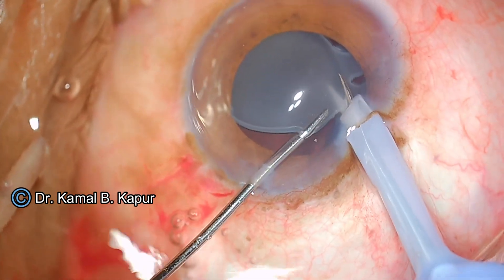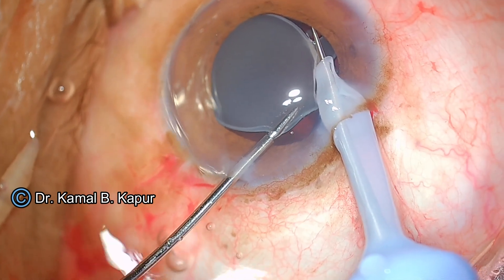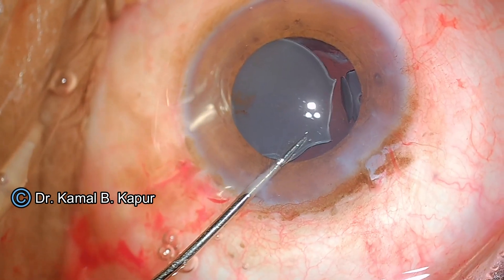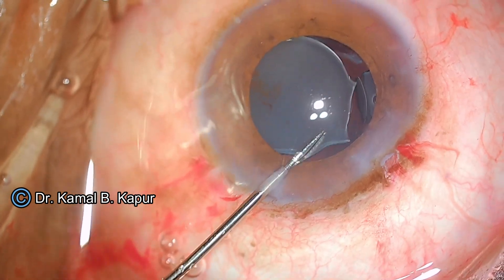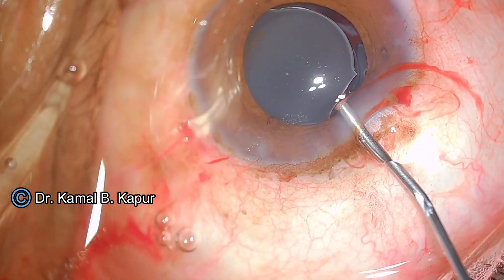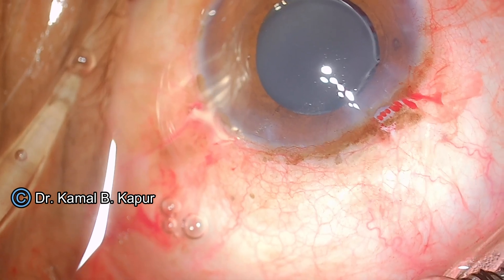Once you grasp the IOL, the trick is to keep pulling the IOL towards the cutter while you press the phaco footswitch. I am using 40% power here, and you can see the cutter has actually cut the haptic-optic junction very easily.